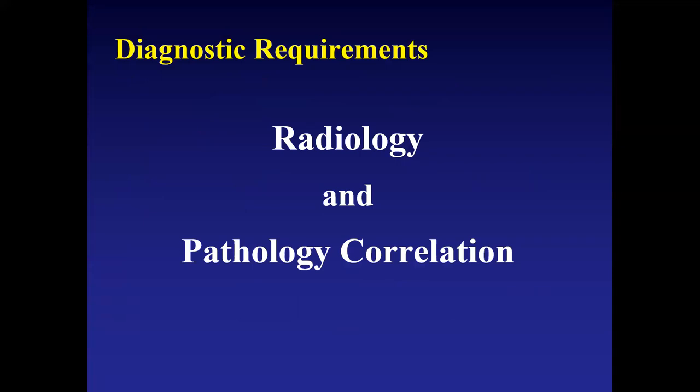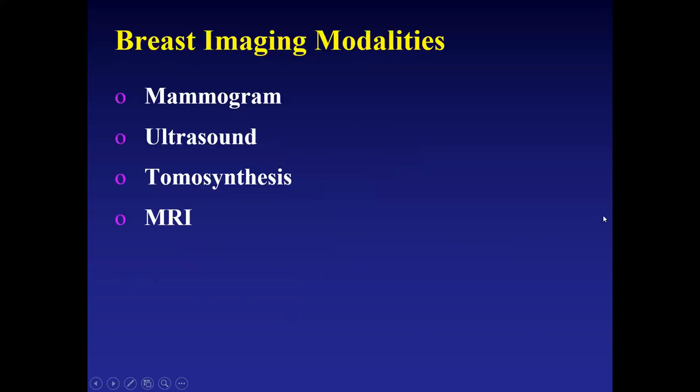Now, one of the most important components in the practice of breast pathology, with minimally invasive procedures of both fine needle and core needle biopsy, is knowing that radiology and pathology correlation is the essential component of this practice. We need to make sure that what we are seeing in pathology, either core needle biopsy or fine needle, is representative of what is being seen in radiology.